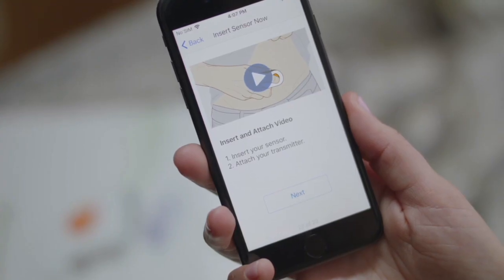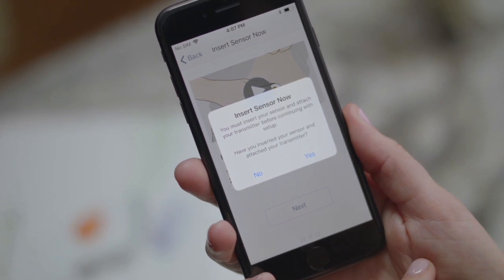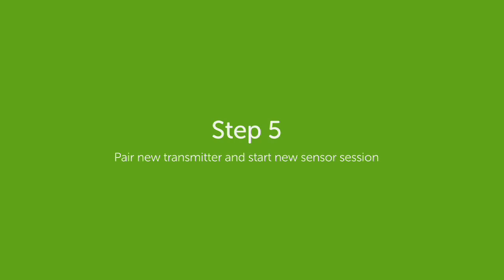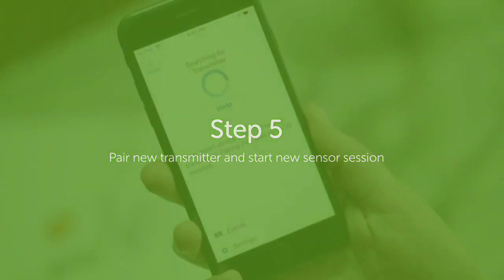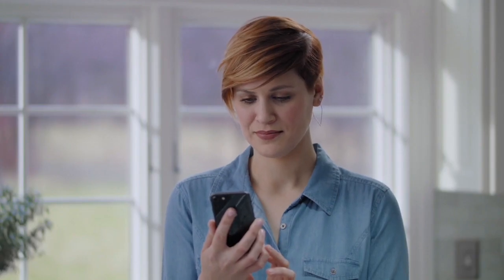Back on the app, tap Next and then Yes on the screen, asking if you have inserted your sensor and attached your transmitter. Now it is time to pair your new transmitter and start your new sensor. Wait for your transmitter to pair and tap Pair. Then tap the Start Sensor button.